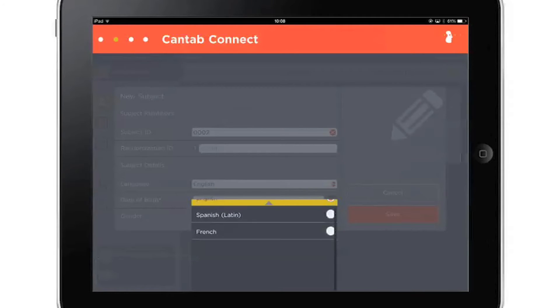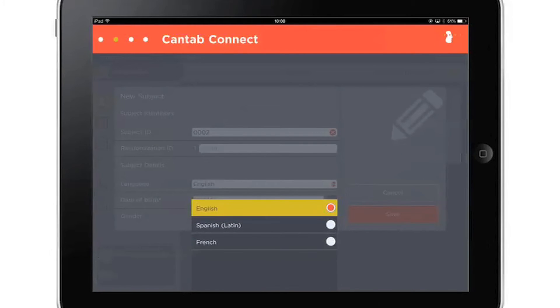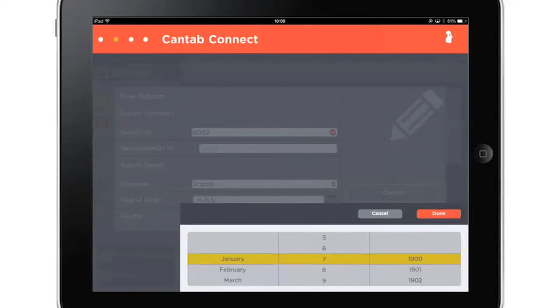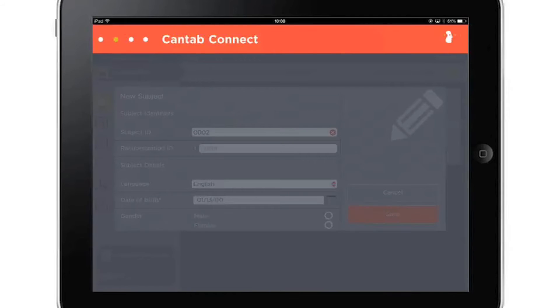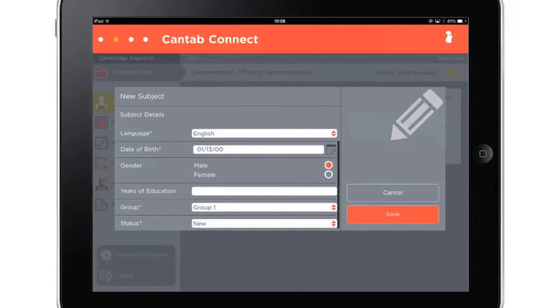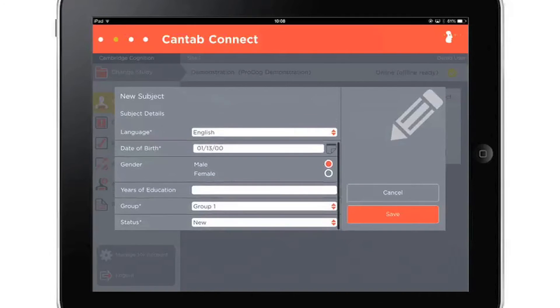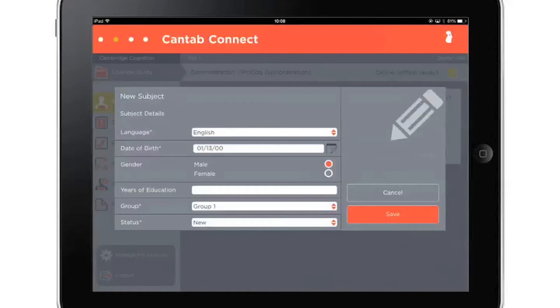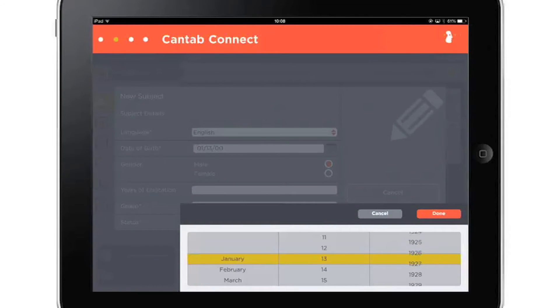Testing languages are selected during study setup and are available to select per subject when entering subject information. To ensure any inclusion and exclusion criteria are adhered to during a study, limits can be set on the demographic details. For example, in this study, participants under 18 and over 70 are excluded, so when a subject who is over 70 is entered into the form, a notification message is displayed.